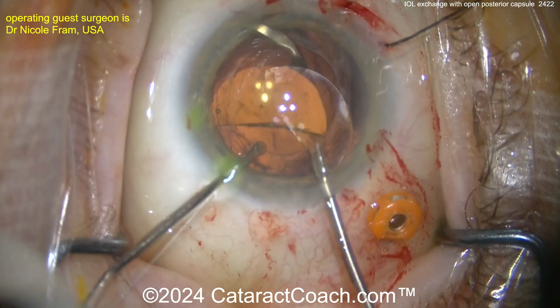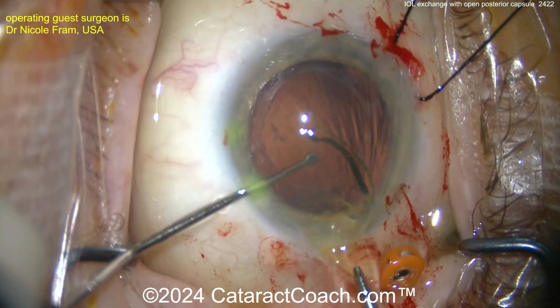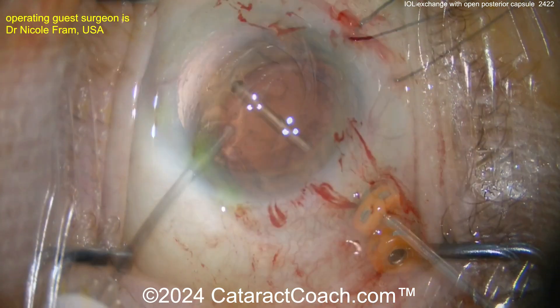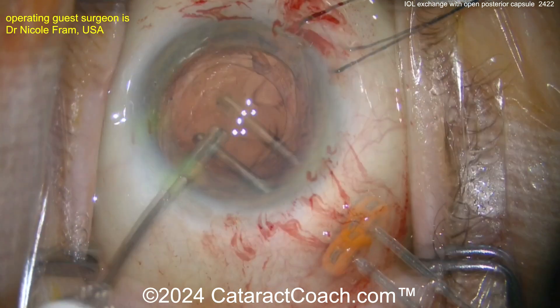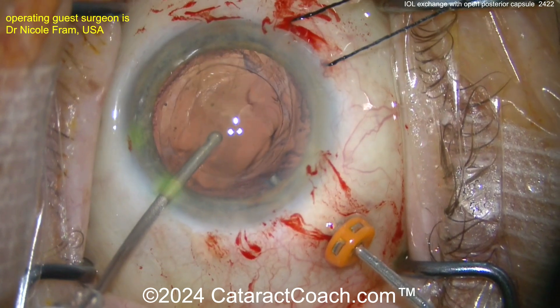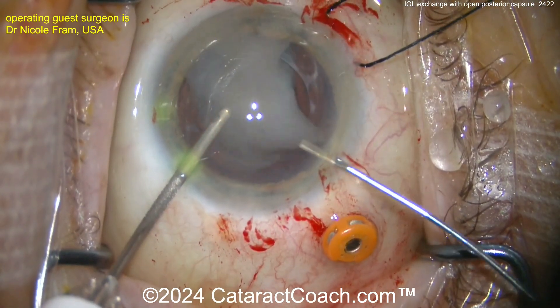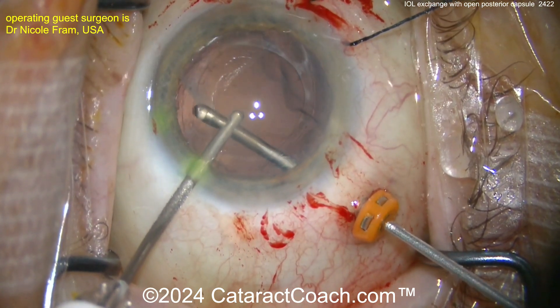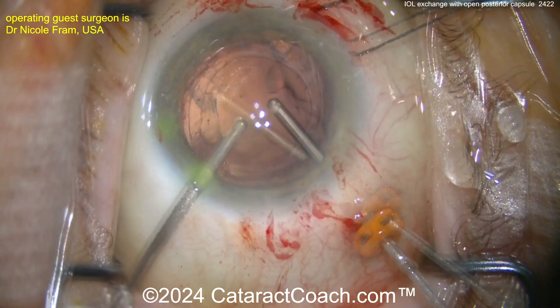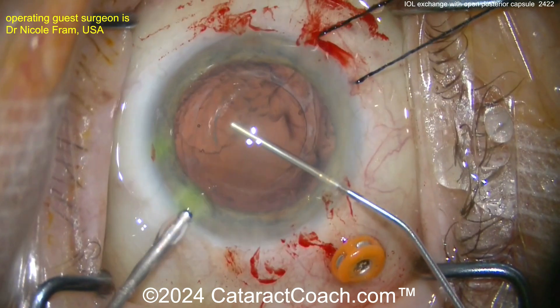Here is the lens being bisected — cut in half — and then pulled out of the eye. We do have the twist-and-out procedure, and Dr. Fram and I are partners in our surgery center, so I'll have to tell her about the twist-and-out technique. Here is a limited pars plana anterior vitrectomy — you can see the trocar there. A little bit of triamcinolone signal going inside the eye to stain the vitreous, and it looks pretty good, cleaned up nicely.